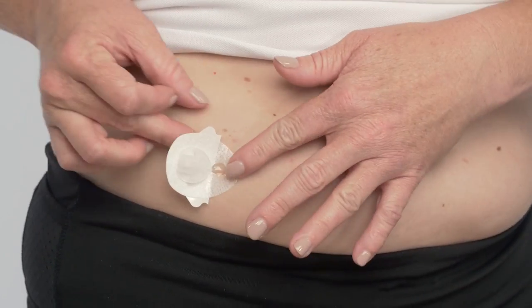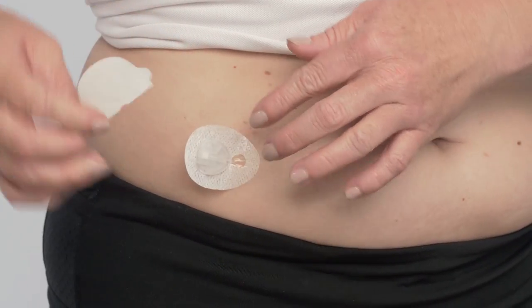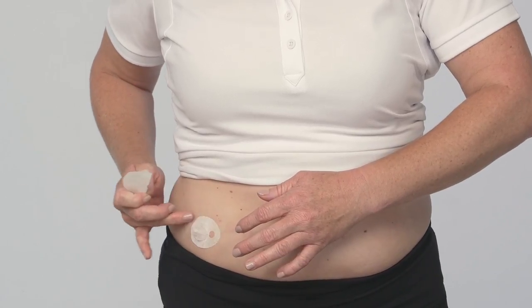Now, place a finger in front of the clear window to secure the cannula. Carefully lift up the back of the adhesive tape. Remove the remaining adhesive backing paper. Press the adhesive tape firmly to secure the infusion set.